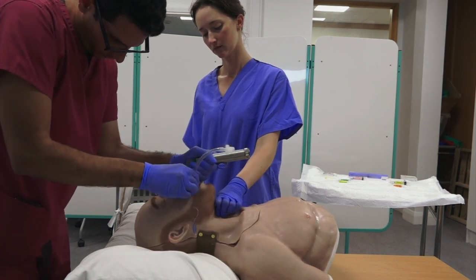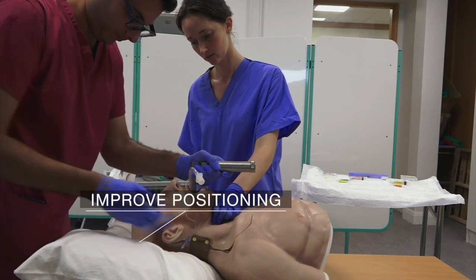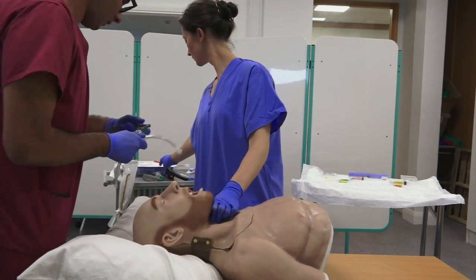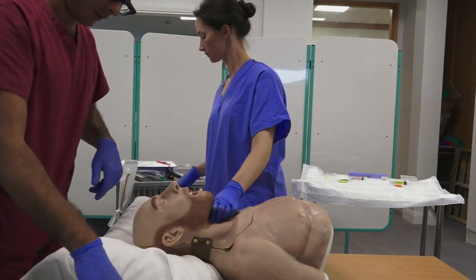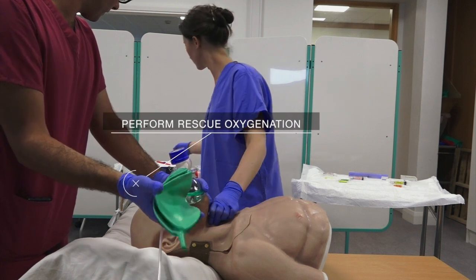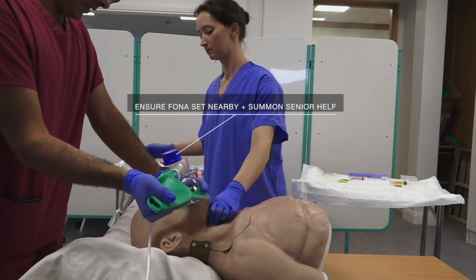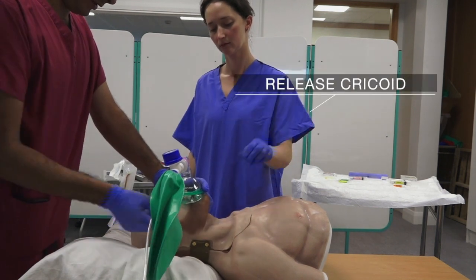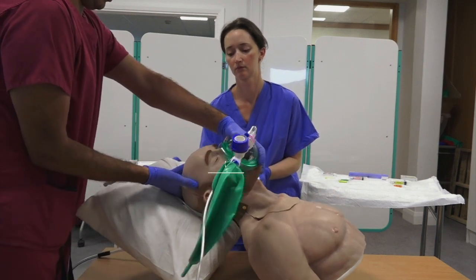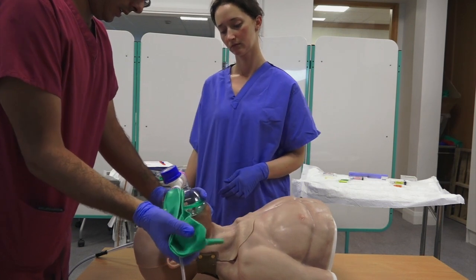If difficulty is encountered, a variety of maneuvers to improve ease of intubation can be attempted, such as optimal external laryngeal manipulation or improving the patient's position. If difficulty is still encountered, abandon the intubation attempt and provide face mask ventilation. At this stage, it is appropriate to summon senior help and ensure the front of neck access kit is available. Consider releasing cricoid force or further improving positioning before the next attempt.